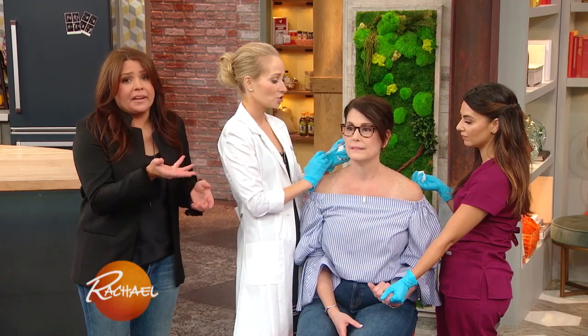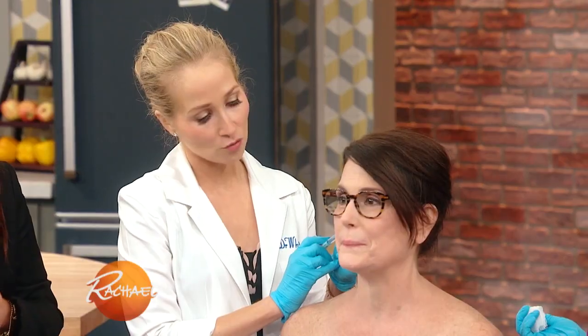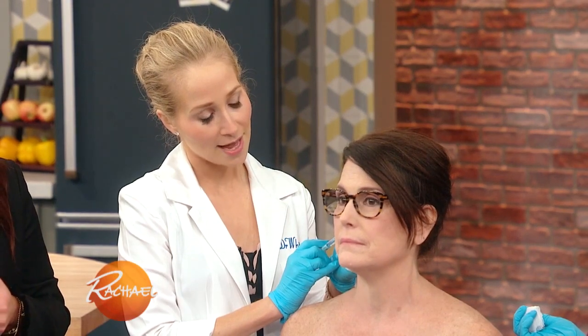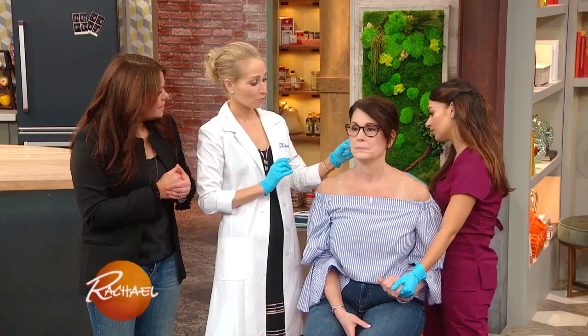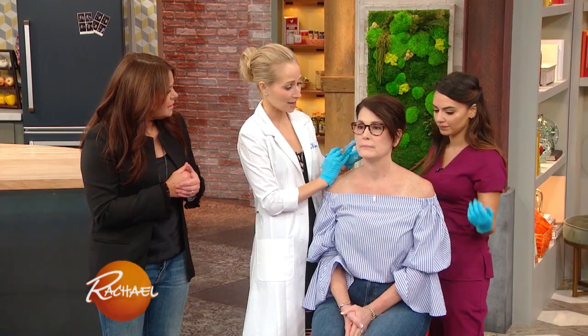All right. So I literally just take a little bit of the gel. It's made of hyaluronic acid. I'm putting a couple of struts of this filler right around. I can see it just puffing up. So we're just putting little supportive struts right around those holes. The results are immediate. So what I'm going to do is just mold it right in place. I'm going to put a couple more pinches in there just to make sure that it's got a lot of support.